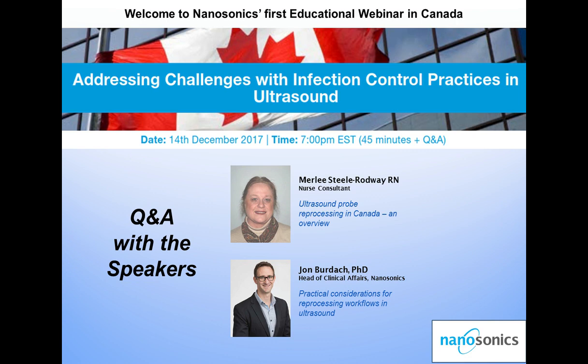I'm a registered nurse. I never go to work expecting to make a med error, but it can happen to us. So the more automated processes you have, the less chance of having any errors or omissions and breaches in your processing. Now, that being said, there would be checks and balances that would need to be put in place if you utilize automated reprocessing methods as well.